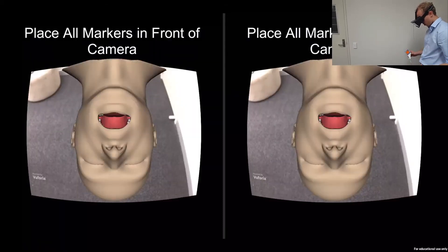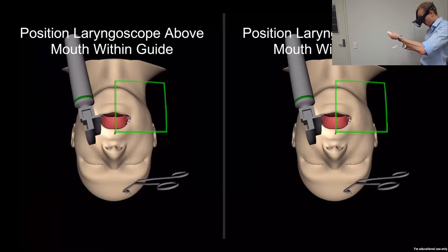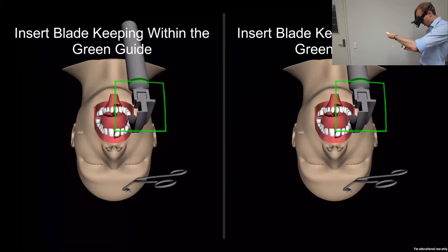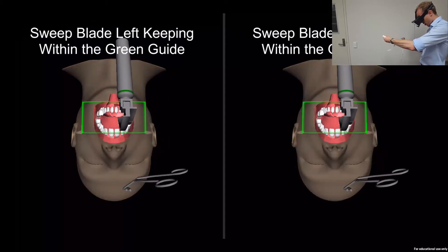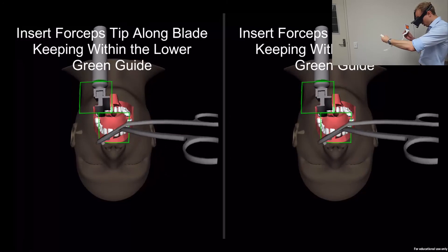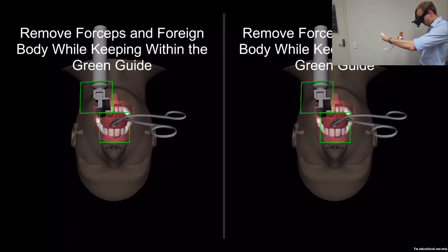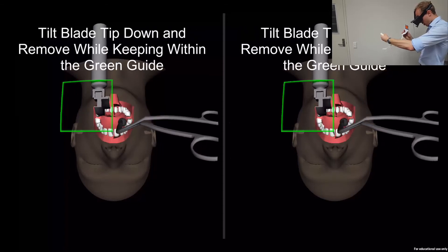Place all markers in front of camera to enable tracking. Position laryngoscope above mouth. Insert blade. Lateral sweep. Lift. Insert forceps. Remove forceps. Remove blade.